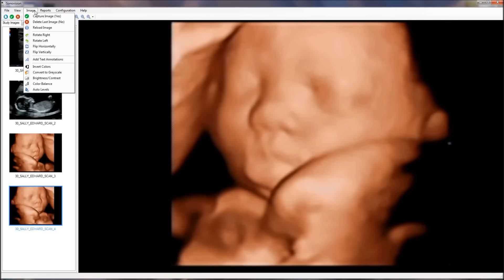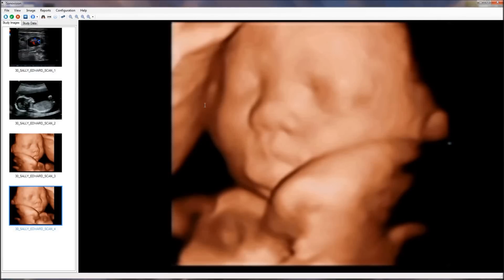To add text annotations to an image, choose add text annotation in the image menu, and type the text on the image.